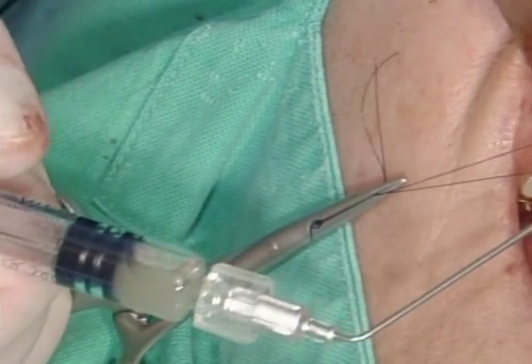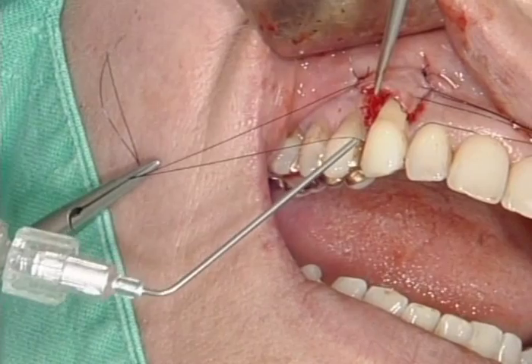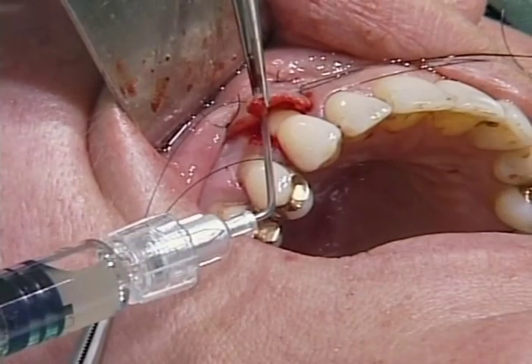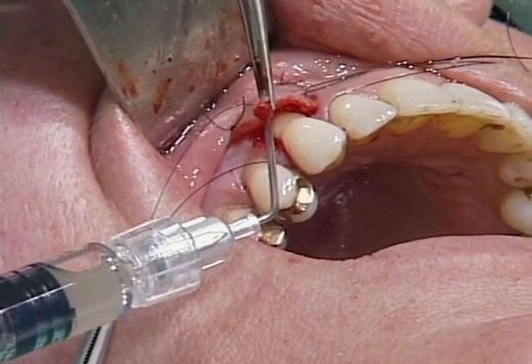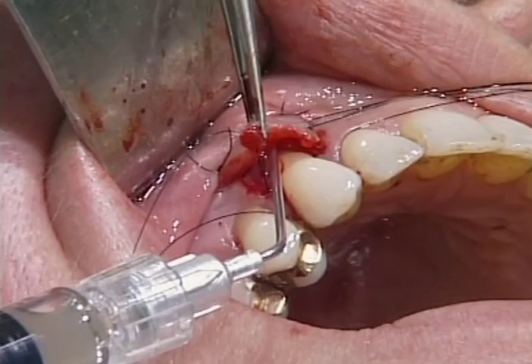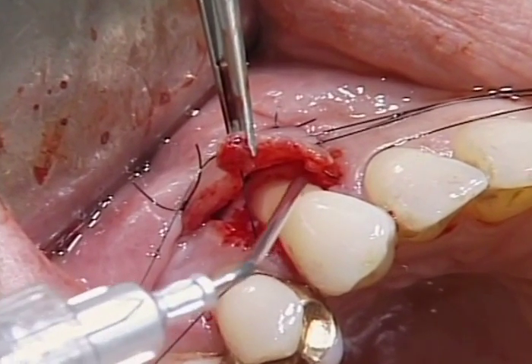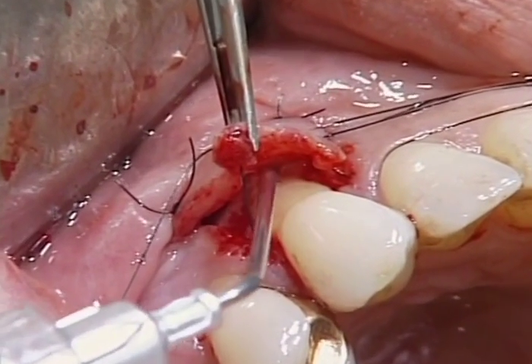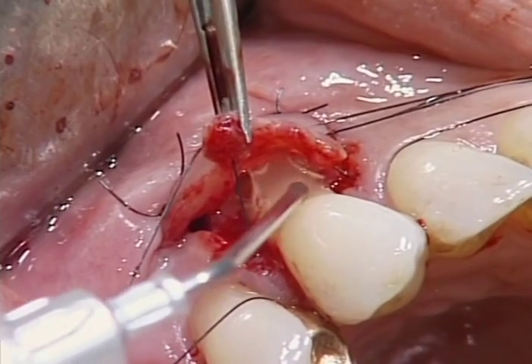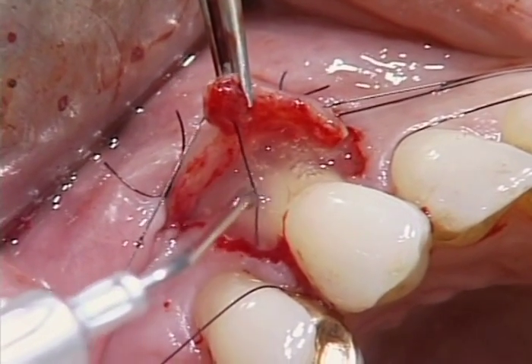EMDO gain comes as a ready-to-use gel in a syringe and is applied immediately. The needle is inserted directly into the defect and EMDO gain is injected until it fully covers the exposed and conditioned root surface.